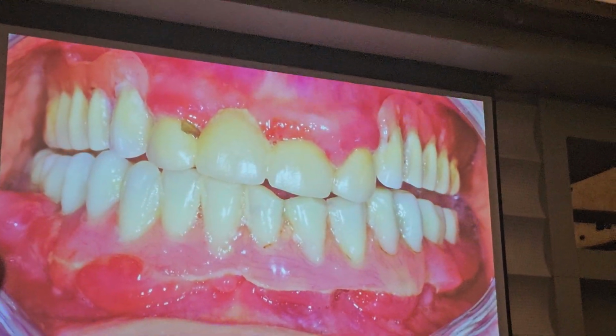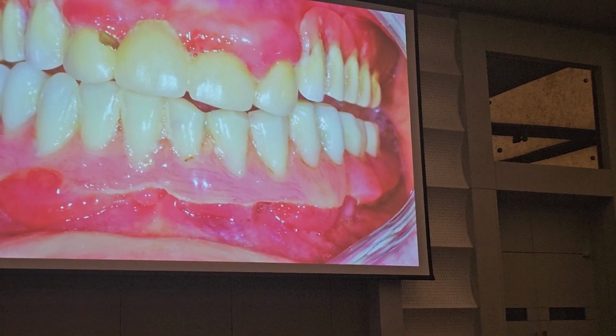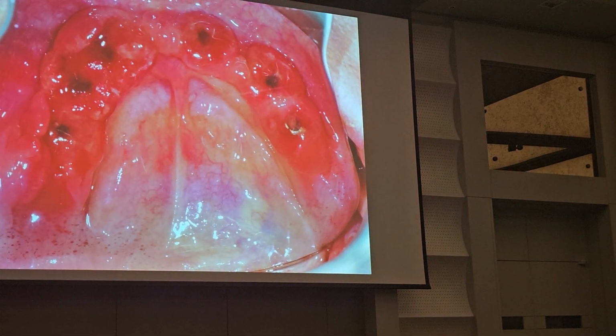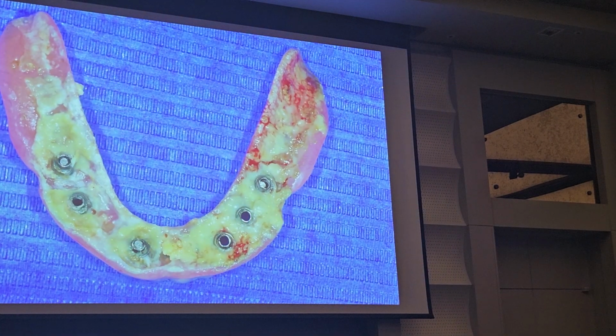So this patient came to my attention because they did full arch cases with the same design I did, with the concavity everywhere. And look what happens. Okay, he did worse than me, but more or less.